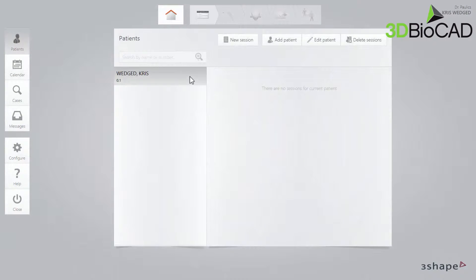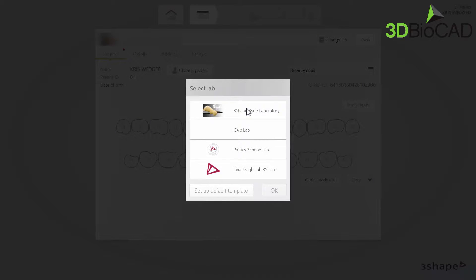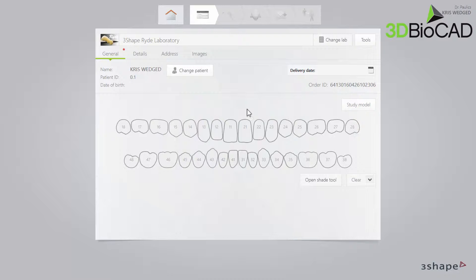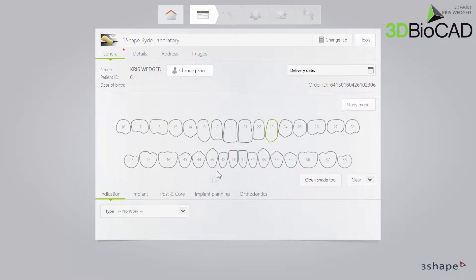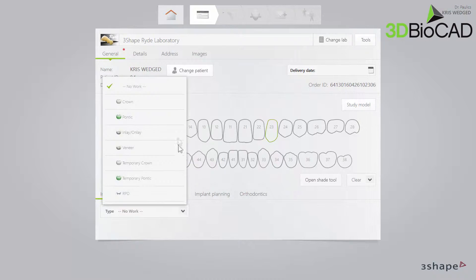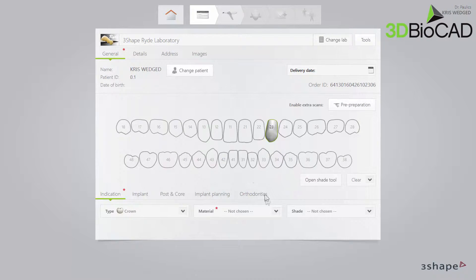Let's illustrate how you may actively use this post-processing when setting the margin line. First we need a scan. Select a patient, create a case and select a lab in the usual manner. Then fill in the order form — select the tooth on which the restoration will be made, the indication, material and other details.